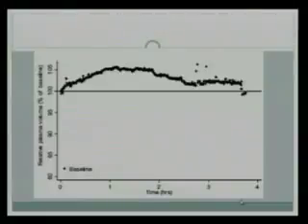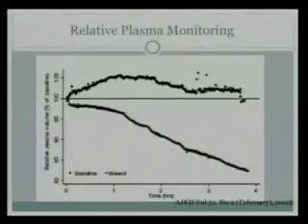So this patient was actually enrolled in the DRIP trial that I just mentioned. And he was randomized to the ultrafiltration group where his dry weight was probed, and he had continuous fluid removal until he was not able to tolerate 0.2 change. And they did the treatment, and after 2 months of treatment, this is what his crit line looked like afterwards.